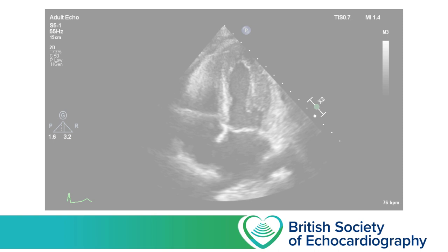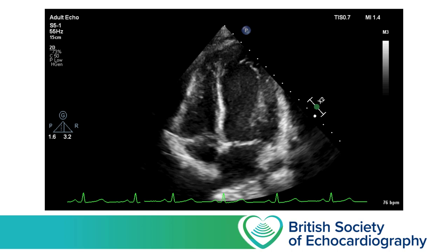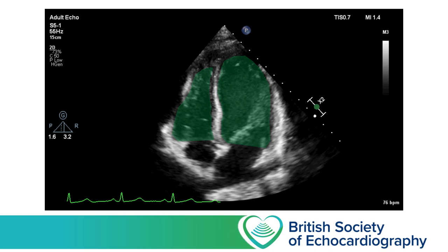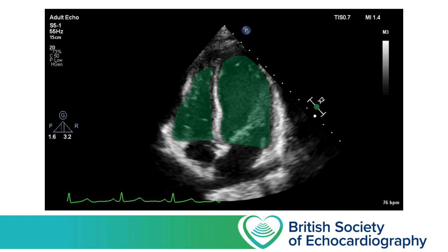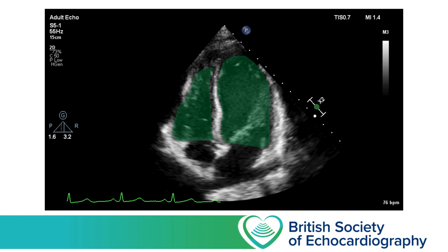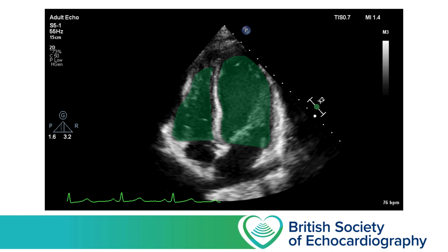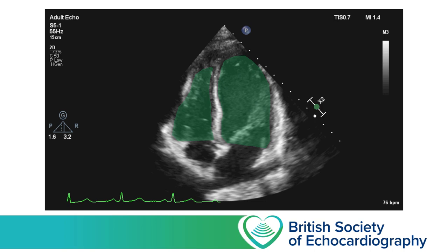This apical 4-chamber view from a healthy volunteer shows the RV appearing much smaller than the LV. Pausing at end diastole: as a general rule of thumb, the RV area should be less than two thirds of the LV area — you can assess this visually. Note also how the LV makes up all of the apex. As the RV dilates, not only will its relative size increase, but it may start to share the apex of the left ventricle or even take over.